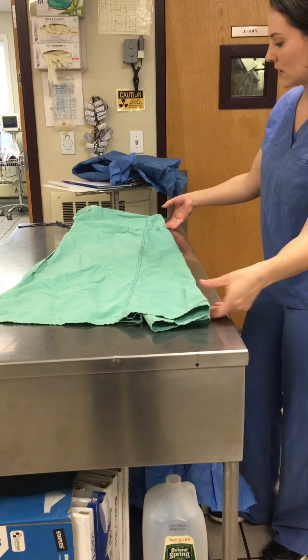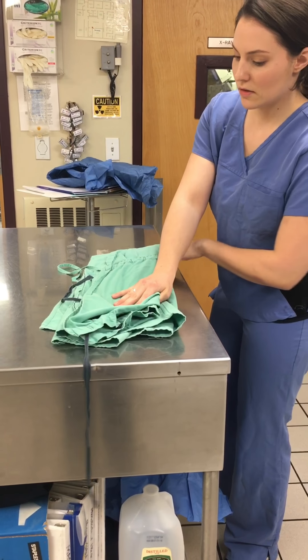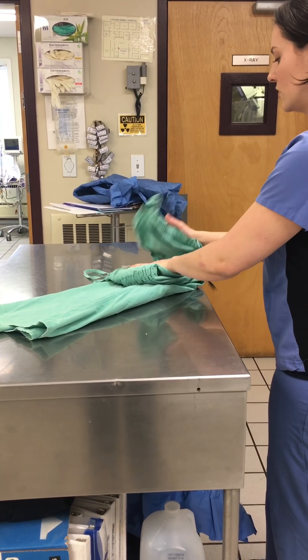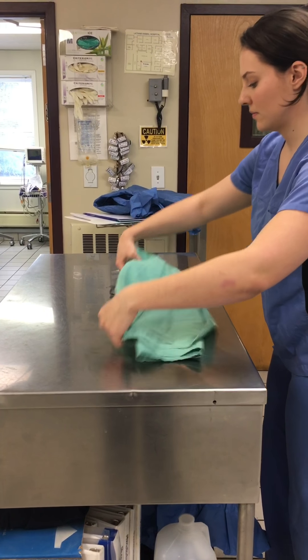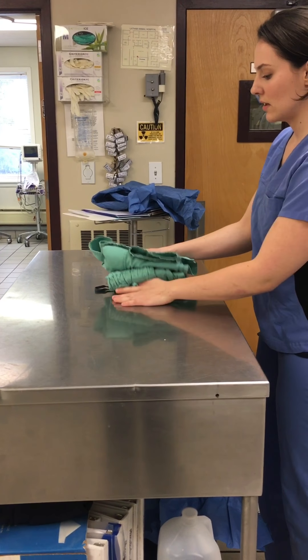Shake it out one more time. I'm going to hold the gown facing the way I would put it on. Fold it inwards. Grab the arm holes here. And then point it flat. Everything is flat and even. Strings are tucked in.